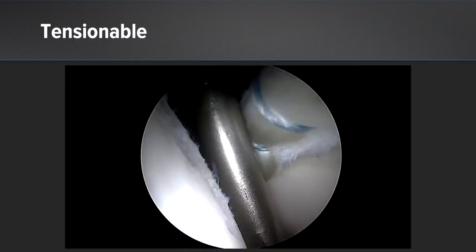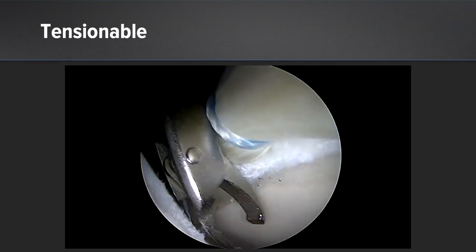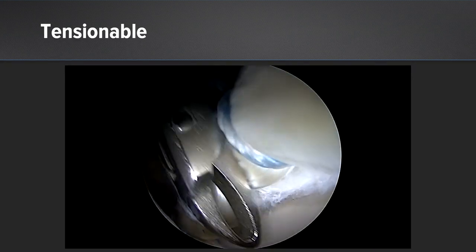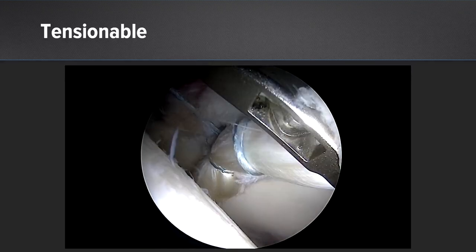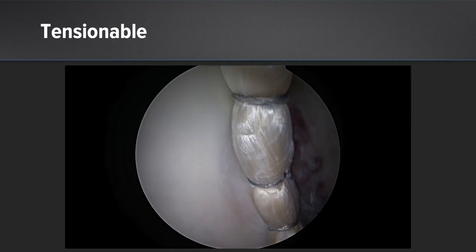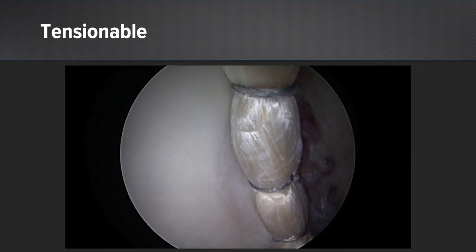As you can see right here, we'll pull it up on the rim again, and then we can go back to our most recent anchor that we inserted and cinched and convert it to tension that as well, which helps us really position this graft right along the rim, so that it's really secured well. And this is the result afterwards, which demonstrates a very well-positioned, well-fixed graft throughout the entirety of the circumference of the acetabulum.